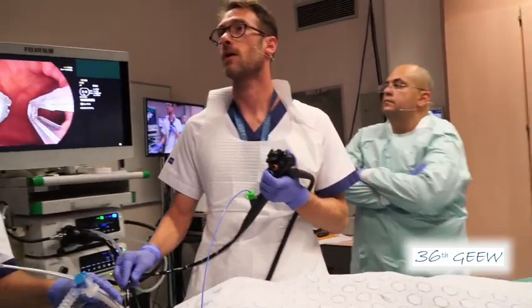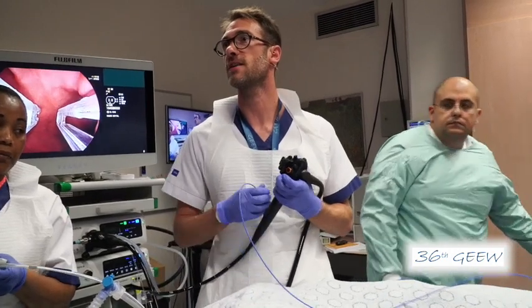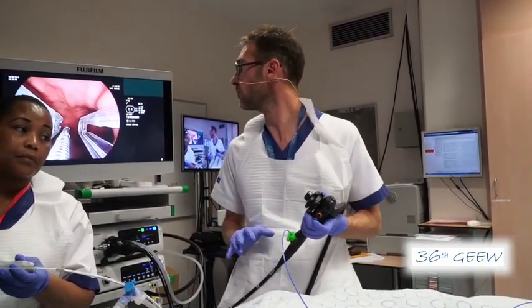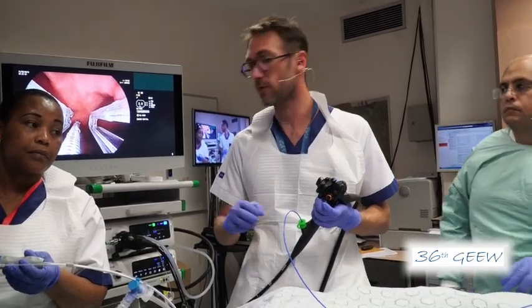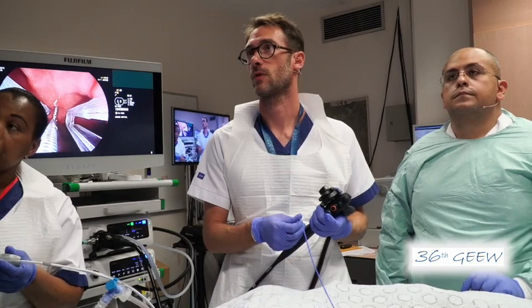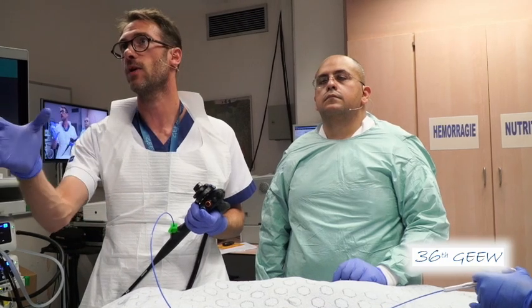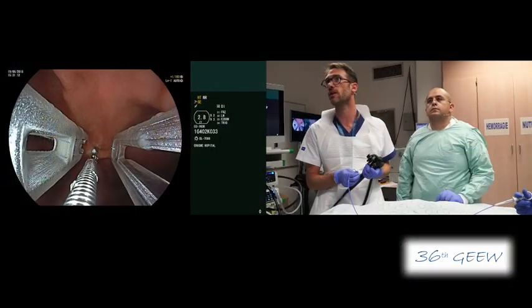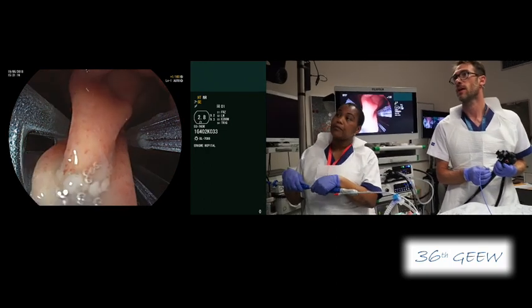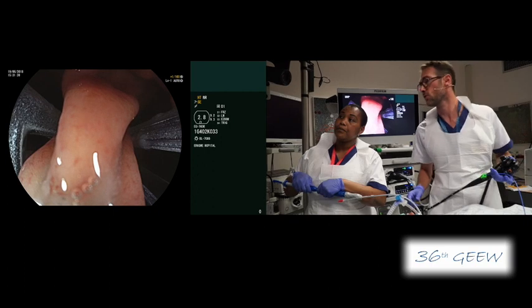I will do the same inside the stomach. We start usually at the size of the incisura. I'm grasping the tissue with raptor forceps, which is coming through my scope. Then I'm pulling back, and we have the Endomina already preloaded with the needle. I'm pulling back everything and then I ask Francine to pierce the tissue with the needle.